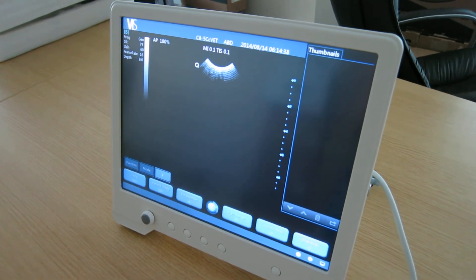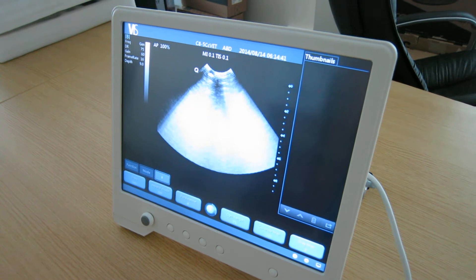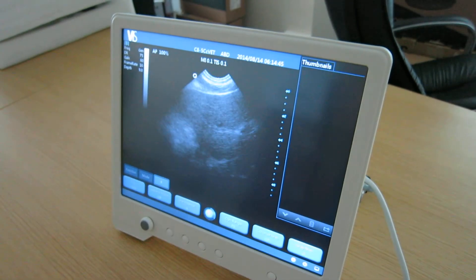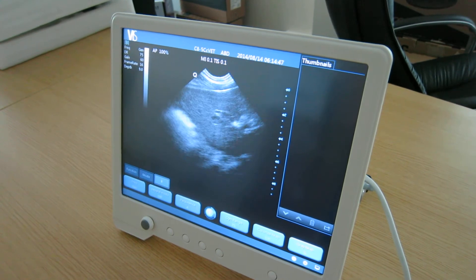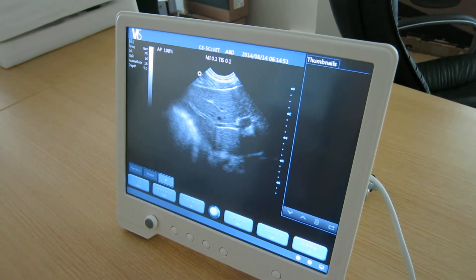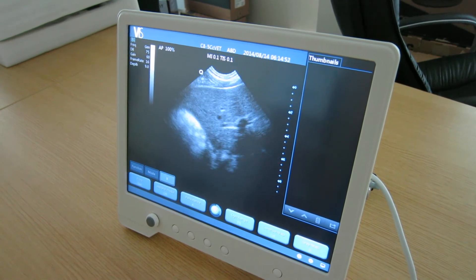Just putting some gel onto my probe. Without any pre-configuration, you can see it picks up a healthy liver structure, even though on the video it looks a little bit more gainy.